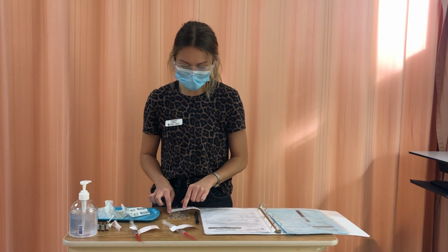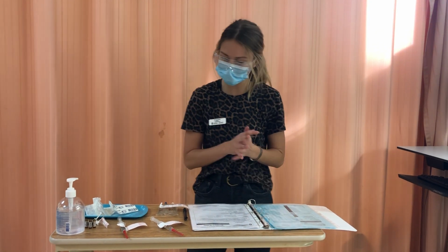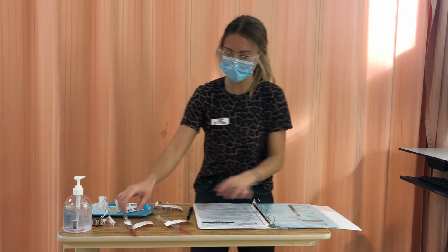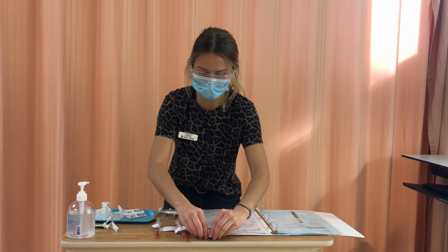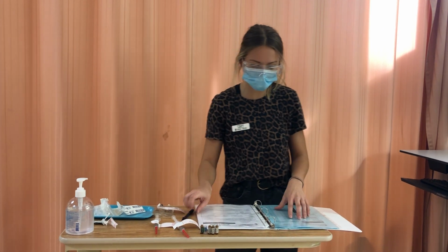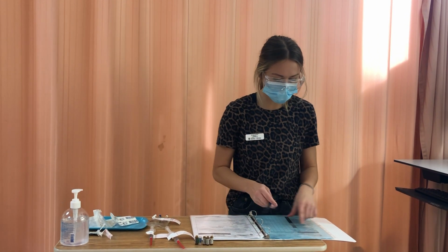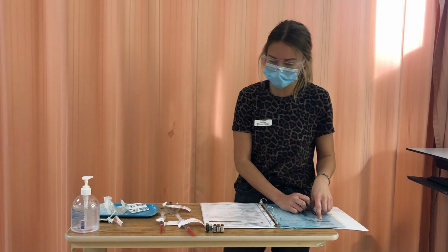And the bolus is 1 milligram, the lockout is 5 minutes, and there's no continuous infusion noted on the doctor's orders. So that looks good. I will now compare it to my MAR, my monograph, and all of my ampules, syringes, and bag. So my patient is Marcy Paris. I have Marcy Paris labeled here. I verified the FIN number. She has no known allergies. The drug that's ordered is morphine 1 milligram per ml.